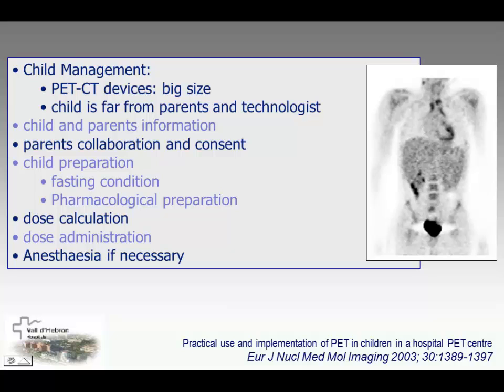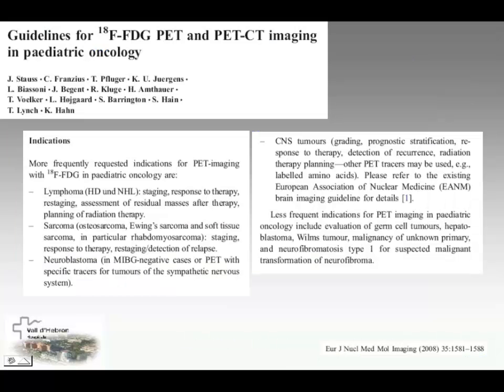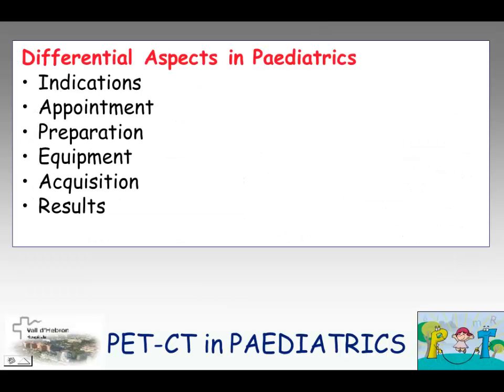And very often in PET-CT, we have to require the anesthetist to acquire the images. These are the guidelines of the EANM, but recently both societies, the SNM and the EANM, published consensus guidelines for the pharmaceutical injection.